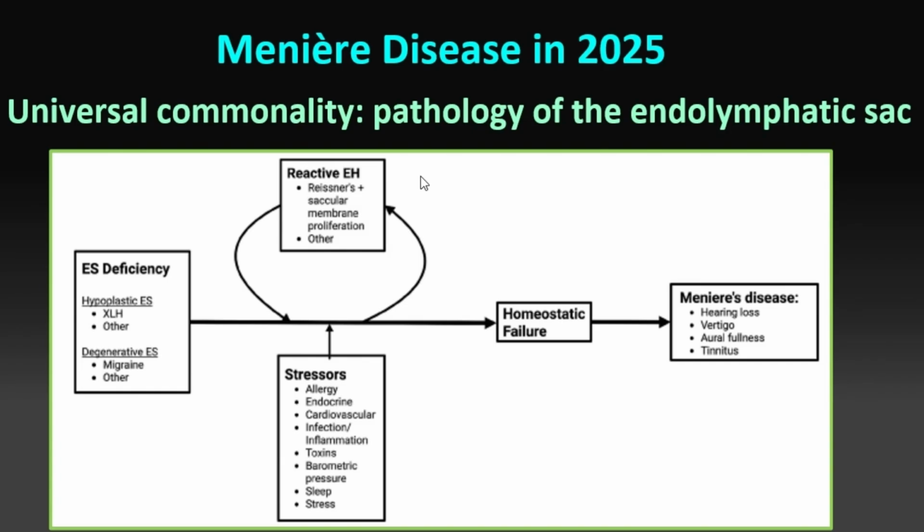So all that is looking at this reactive, we think, this reactive phenomenon where this space got big. So the biggest development our group has done at Mass Eye and Ear is to say, okay, that's fine. And we can have that be complementary with diagnosing by clinical diagnosis, which is how Meniere's disease has been diagnosed for as long as we could remember. Major criteria, minor criteria, all clinical. Now we have an anatomic radiologic adjunct, which is this hydrops seen on MR.